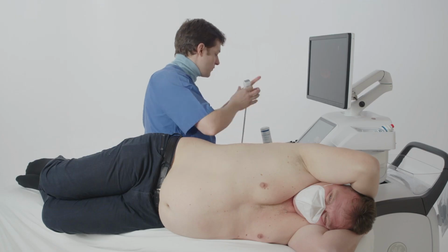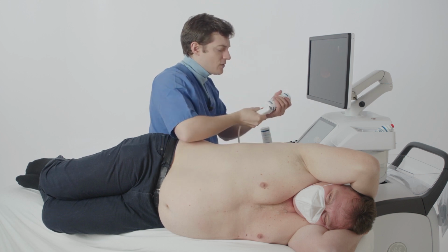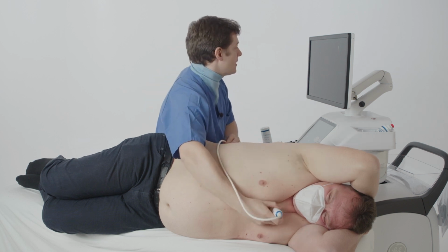We use, of course, a cardiac transducer. This is a special transducer which also enables 3D echocardiography. We need ultrasound gel, and then we start at the parasternal long axis view.